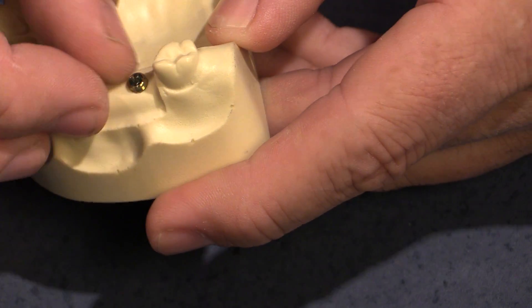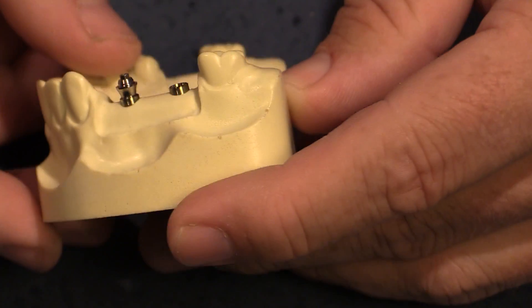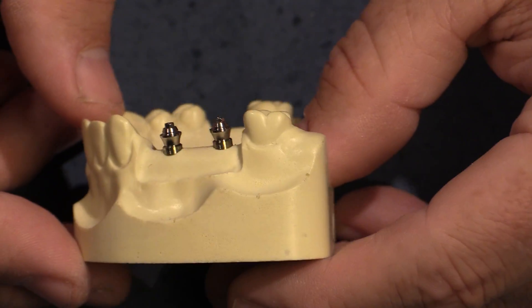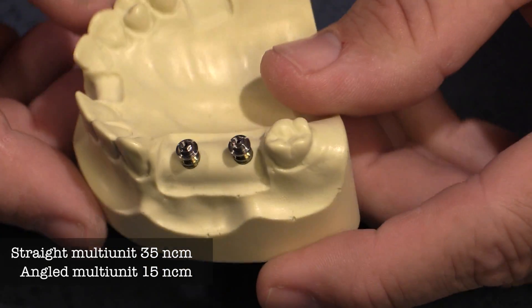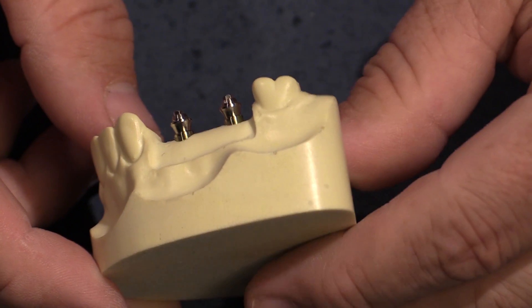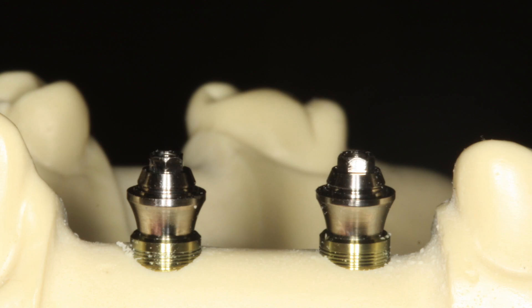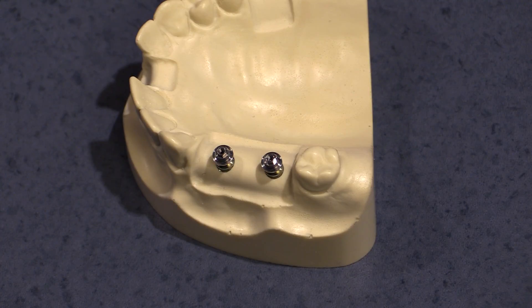We're going to take a multiunit and screw it down on the implant replica to show what the connection looks like. These implants are left a little high so you can see the connection. On straight multiunits, tighten to 35 Newton-centimeters; if you're using an angled multiunit, it's down to 15 Newton-centimeters. One limitation is that multiunits use up some prosthetic space, so you need to have enough restorative space. However, they correct angulation and maintain screw retention while preserving the platform shift.